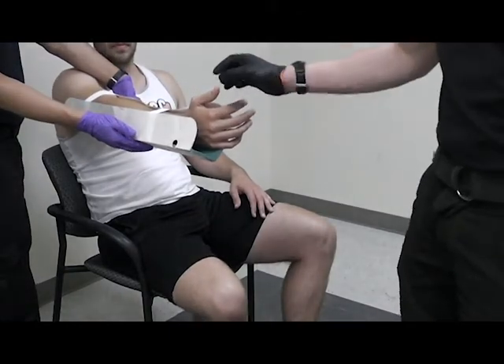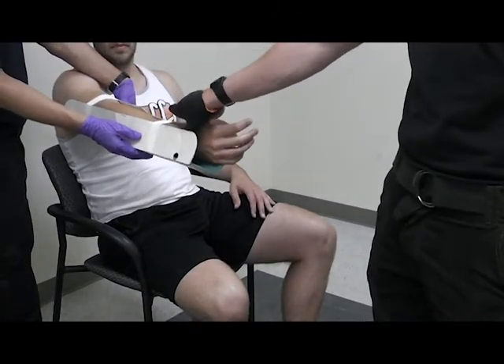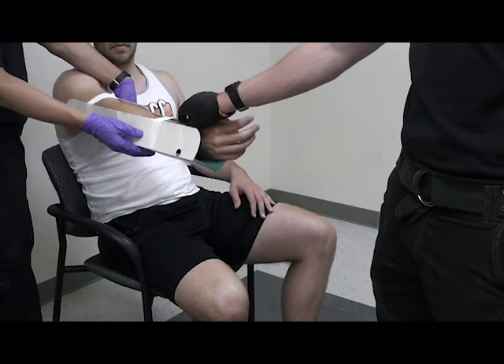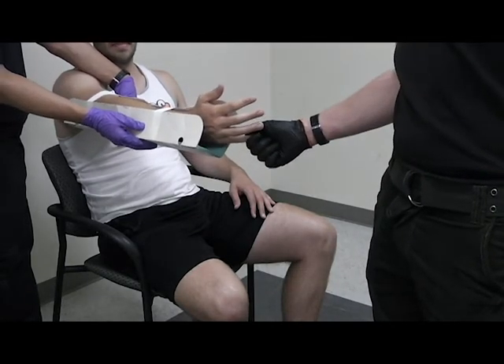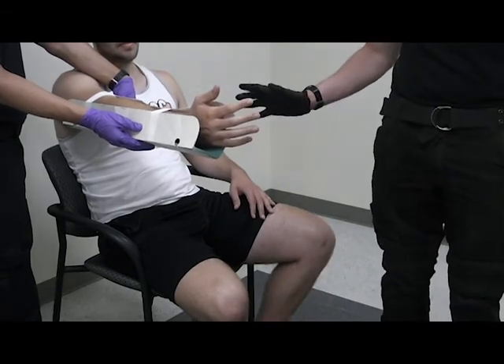After you apply the splint, you want to recheck CSMs — this pulse is still there. Grab my finger. Which finger am I holding? Pinky. And that's it — and transport.